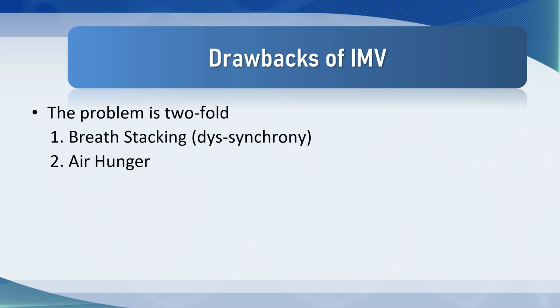The first problem is breath stacking. And breath stacking means that the patient might be trying to take a breath themselves at exactly the time the ventilator decides it's going to discharge into their lungs. So they make it a massive tidal volume.